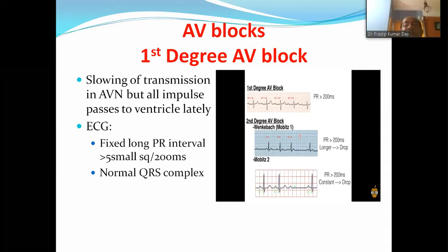Here the PR interval is more than 200 milliseconds. Nothing abnormal here. All the complexes are transmitted to the ventricle, and the ventricle is conducted by atrial conduction lately.